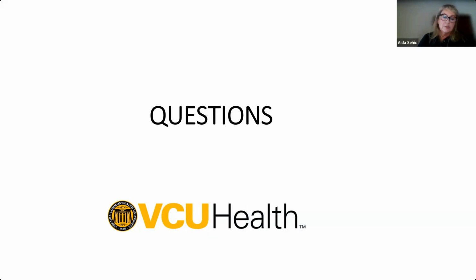What we do is we share our screen in the operating room, big screens, so everybody can see our signals. My big desire for many years would be to have neuromonitoring recordings as a standard information for the operating room, to have it available for everybody and share if there is changes in the cerebral flow, oxygenation, how it's affecting nerve function. And I can tell you the team becomes so dependent seeing those signals displayed on the OR monitors that if it's not there, if we have connection problem or cable problem, they start looking for it.